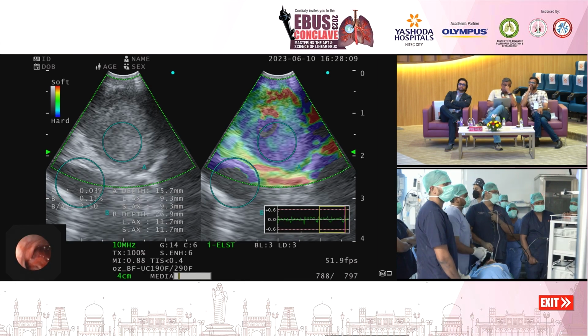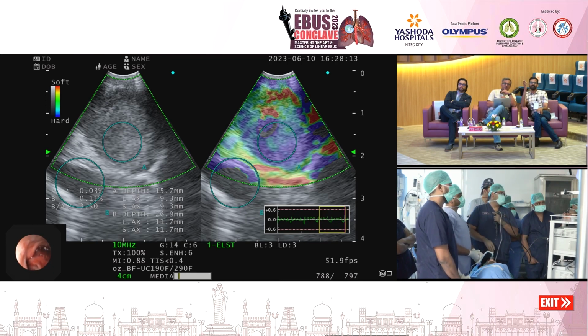But anyway, see here you have not marked the B correctly. B is not in the elastographic image. Nevertheless, this is one of the modes, one of the semi-quantitative ways to assess.